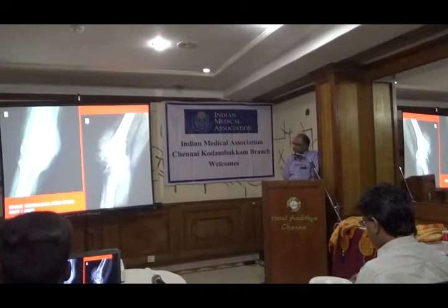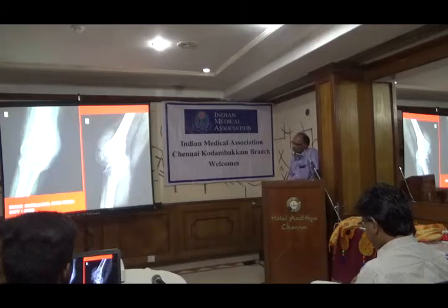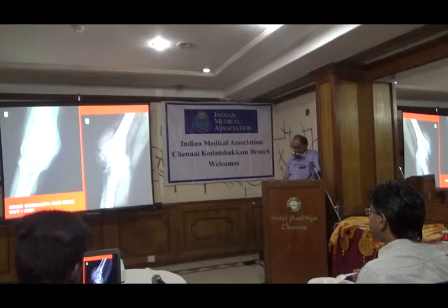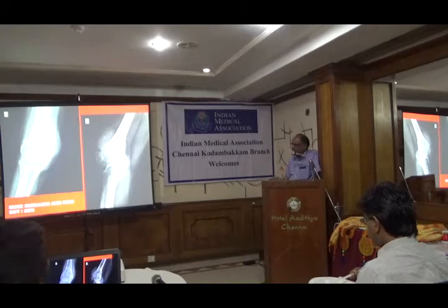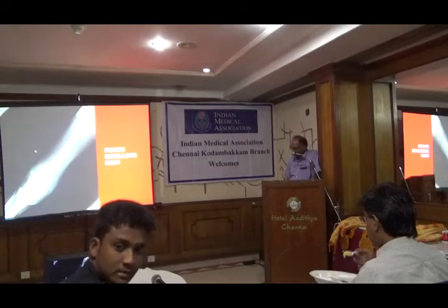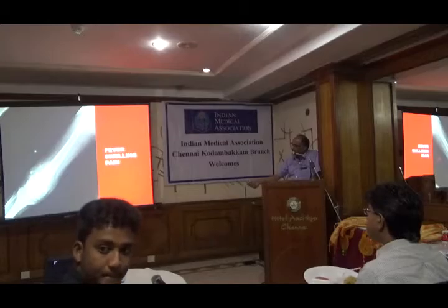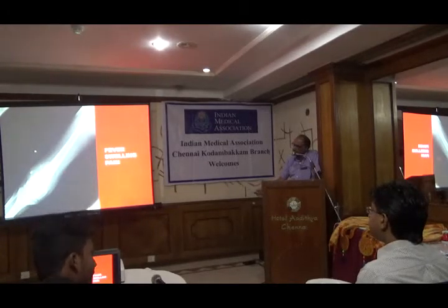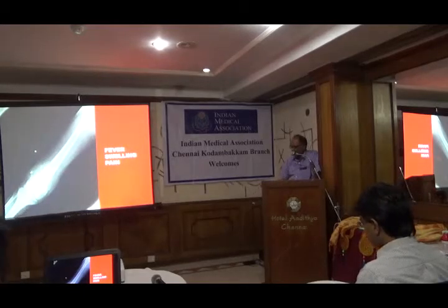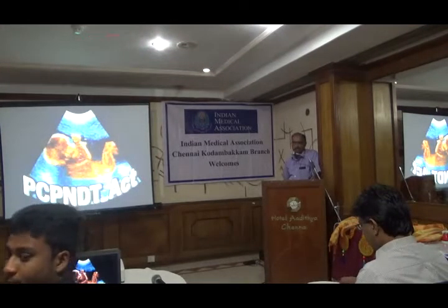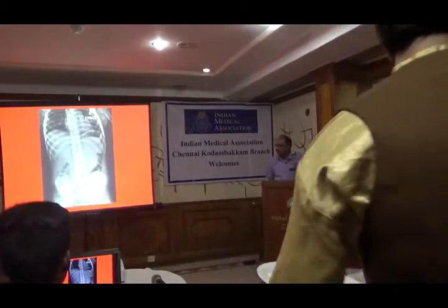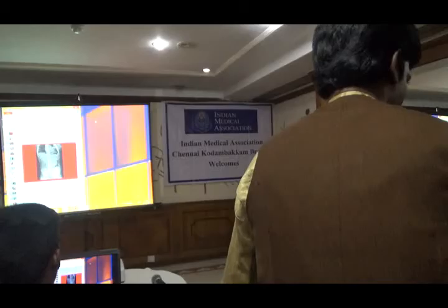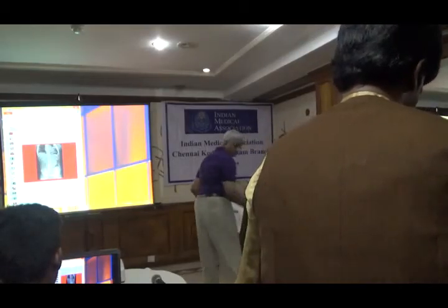Sometimes there are surprises when you take an X-ray. You see a soap-bubble appearance — a typical multi-loculated, expansile lesion — that is a Giant Cell Tumor (GCT) or an Aneurysmal Bone Cyst (ABC) of the lower end of the femur. Here is a small pediatric patient presenting with fever, swelling, and pain — this is an osteosarcoma of the lower end of the femur.